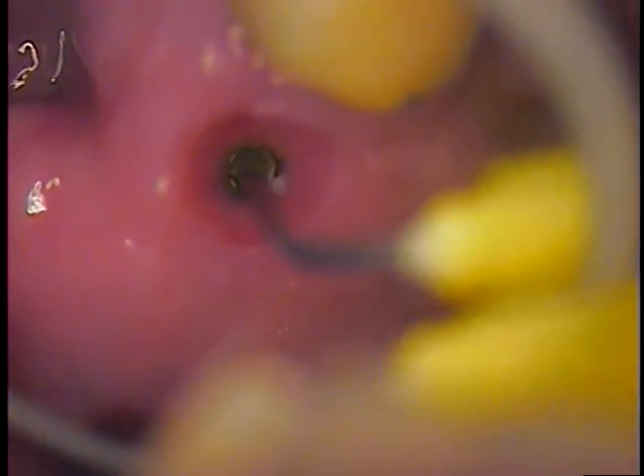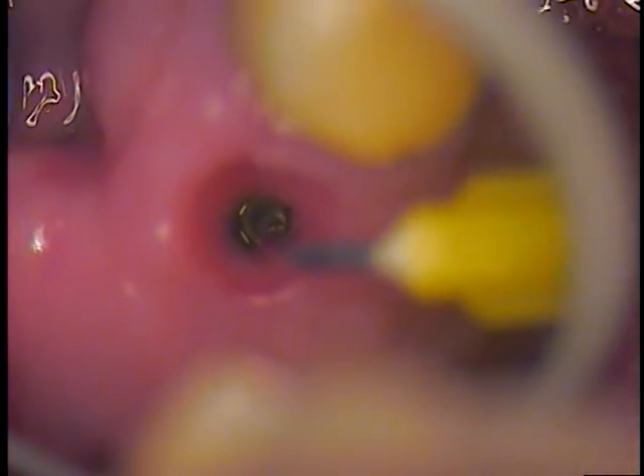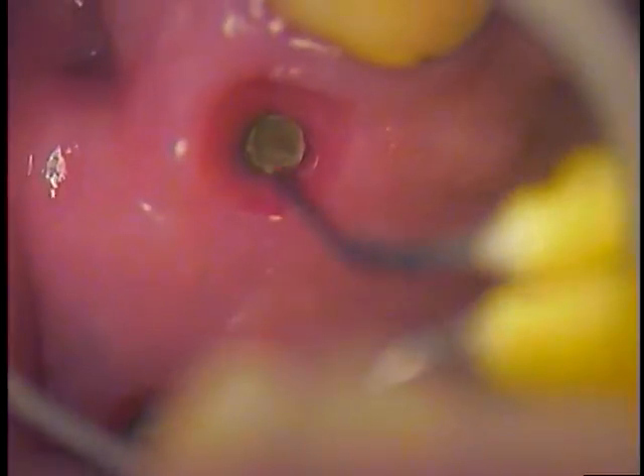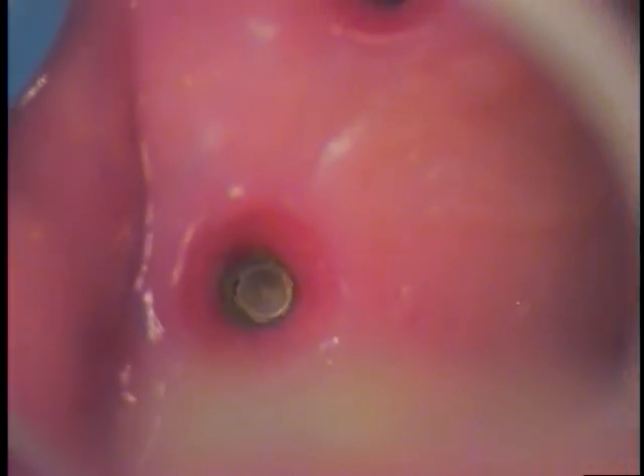You can see every time there's epithelial tissue. Look how well that tissue adapts — it's such a narrowness to it. Those implants are subcrestal, meaning they're below the height of the alveolar bone. Let me get that in focus. If you can see the one in the back — there they are.